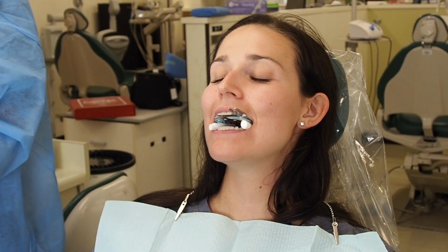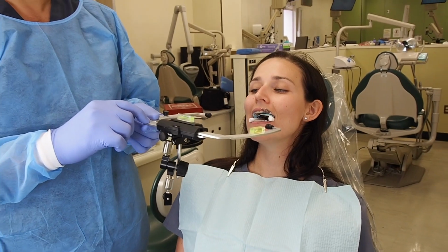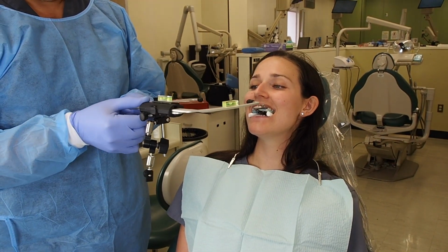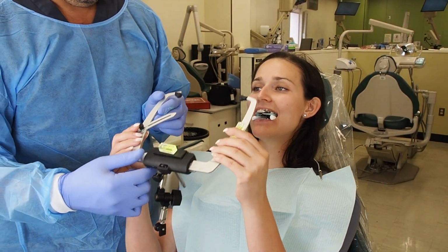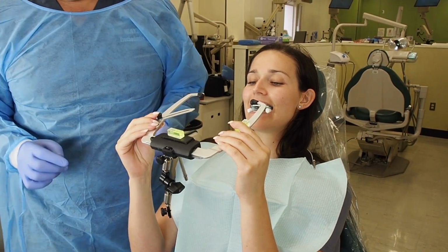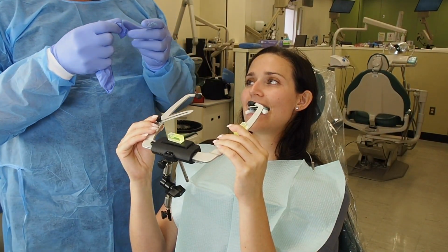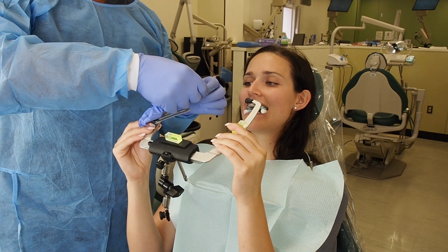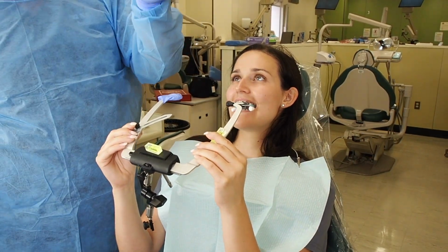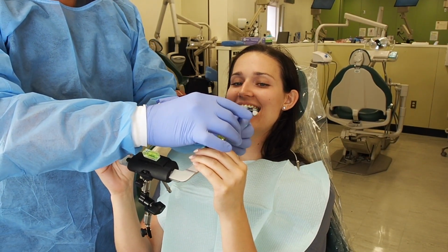The next thing I'm doing is I will have my patient place the Facebow to make the record. So if you want to hold this for me, thank you. We previously have already put together the articulated arm on it and secured it, right? In order for me to keep it nice and clean, I'm gonna grab a glove and take the fingers off of it and we'll use them as protective barriers.